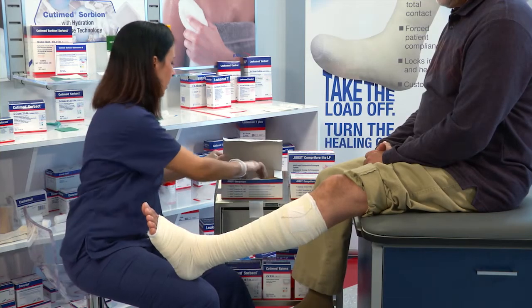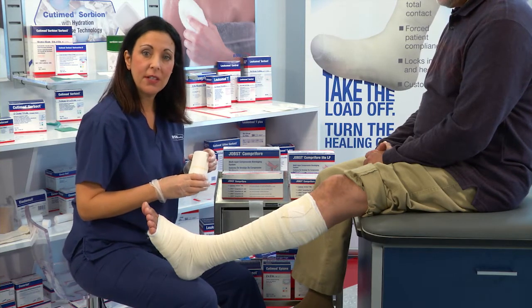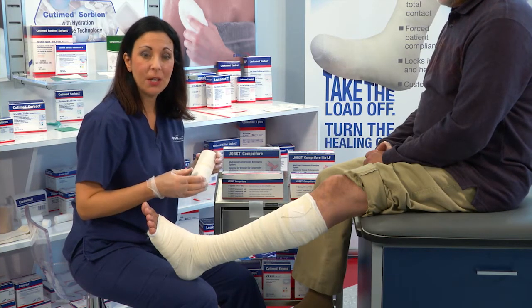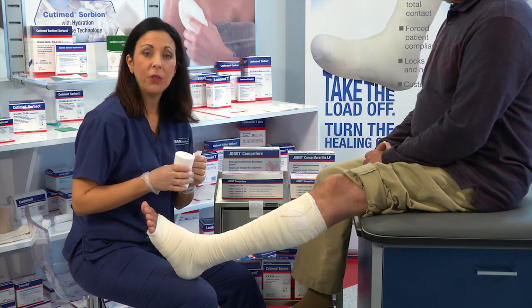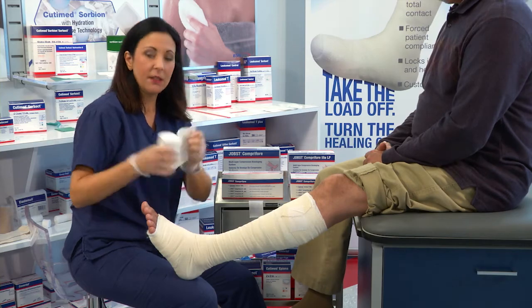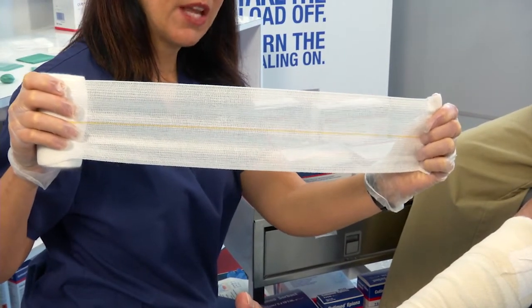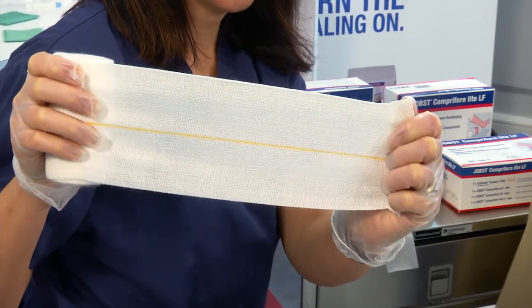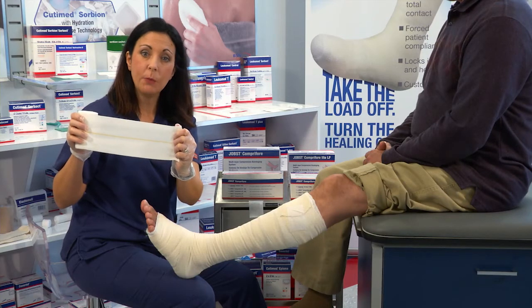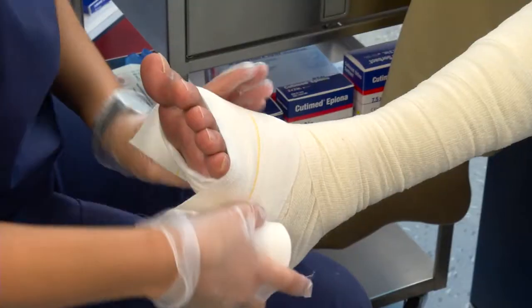Next, we're going to apply layer number three. Layer number three is the first compression bandage. It delivers 50 to 60% of the total compression. We're going to apply this in a figure of eight spiral fashion up the leg with 50% tension. This is a long stretch bandage — 100% extended, you want to come back about 50%; that's when you know you have the proper tension. Jope's Comprofor has both components of long stretch and short stretch bandages. This delivers moderate working pressure and moderate resting pressure.